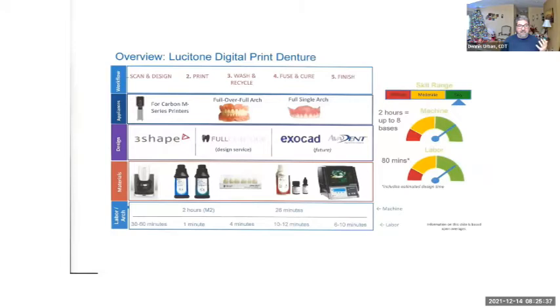And there's other technologies out there. Like I said, other companies doing this very successfully. But this is one of the things that we're utilizing throughout the National Dentex and DSG network. And this is just a slide of how fast it is compared to the traditional way of making a denture, which doesn't really matter too much in the operatory, but in the laboratory, it helps us with manufacturing.